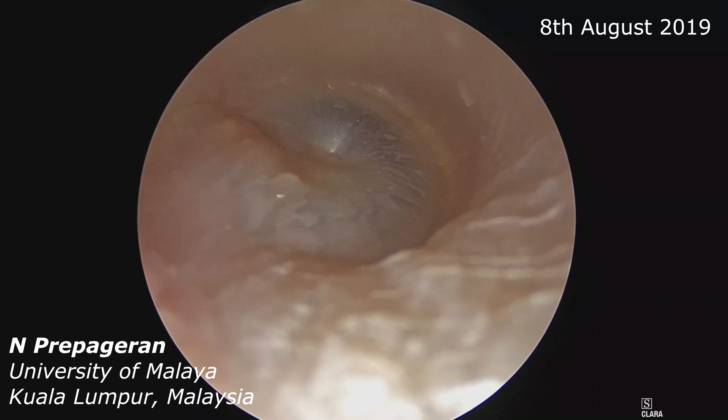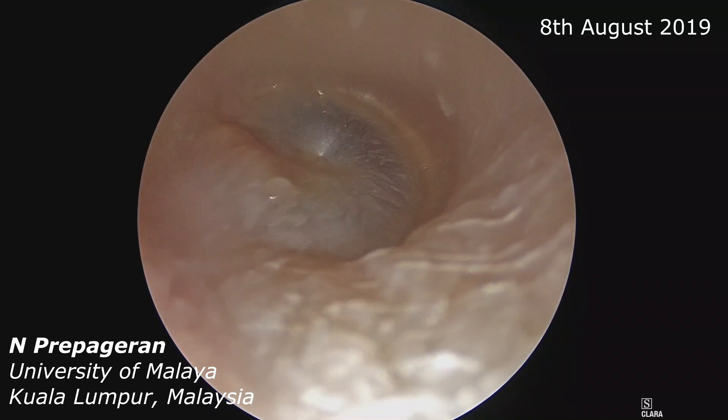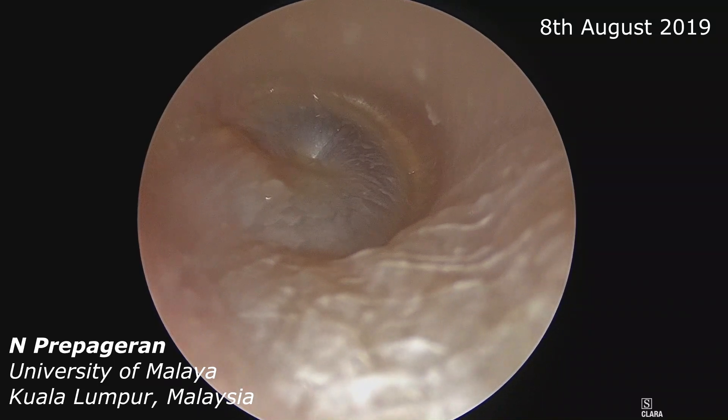Endoscopic ear dissection. Here you can see very nicely the ear canal.